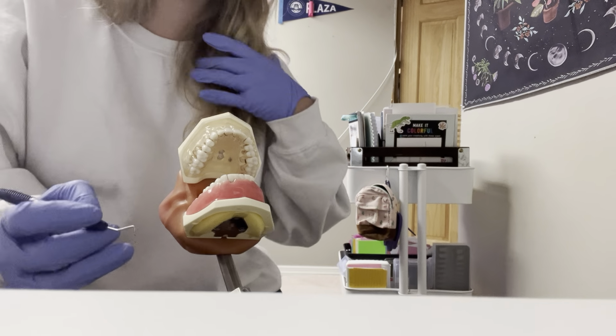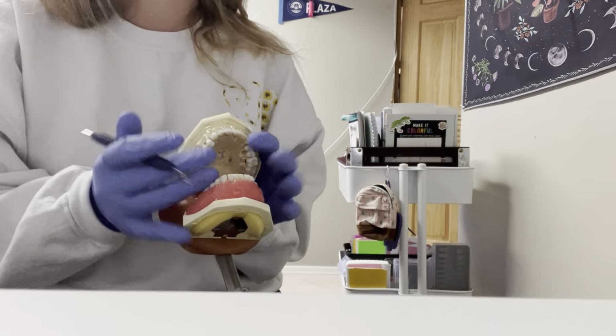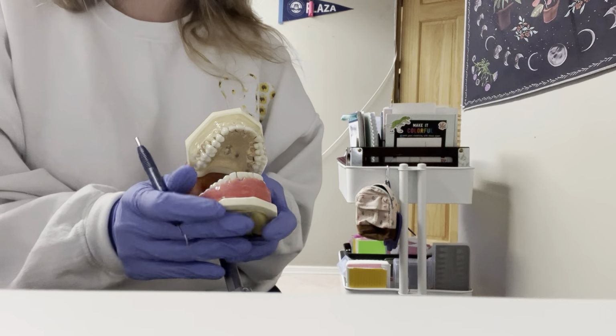So how we probe is we're going to measure from the gingival margin all the way to the junctional epithelium. You'll be able to feel when to stop, and also on a live patient, you can see the tissue blanch.